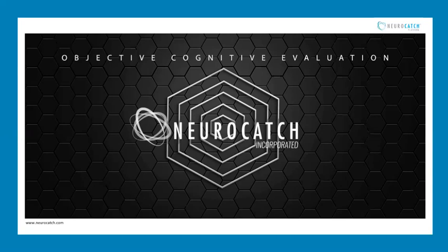We talked about the fact that the raw EEG you can then pair with ways to stimulate the brain and specifically extract the smaller signal embedded in that of how your brain is processing a stimulus. So whether or not it's a tone or any other sort of stimulus.